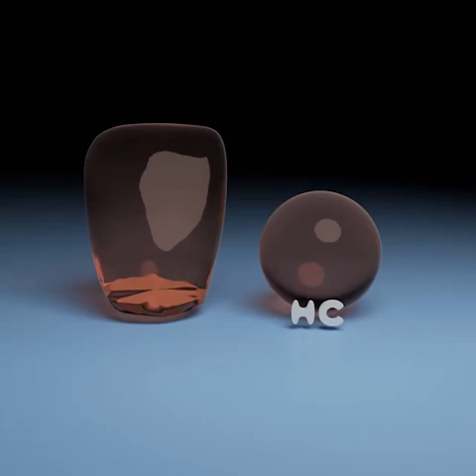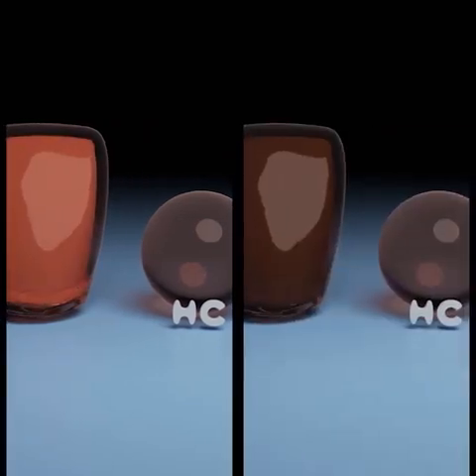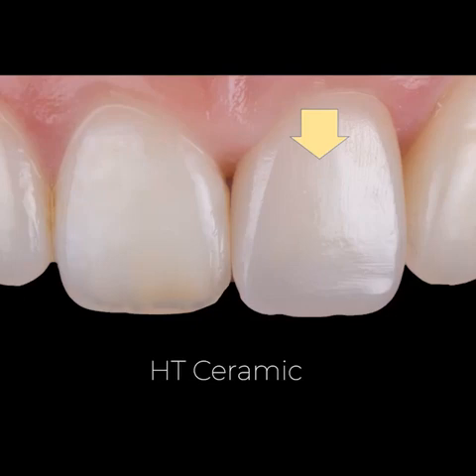One thing you'll notice straight away is that when translucency goes up, the crown looks darker. This is an exaggerated example, but it illustrates the biggest challenge when you rely on the actual translucency of ceramics. It is difficult to increase the brightness of a very translucent ceramic, especially if your ceramic is thick, and so you need to choose your material very carefully. And if your ceramic is thin, then it will be easily affected by the color of the tooth underneath. Of course, in real clinical cases, it won't be this extreme, but our eyes are surprisingly sensitive when the brightness of two things don't match.